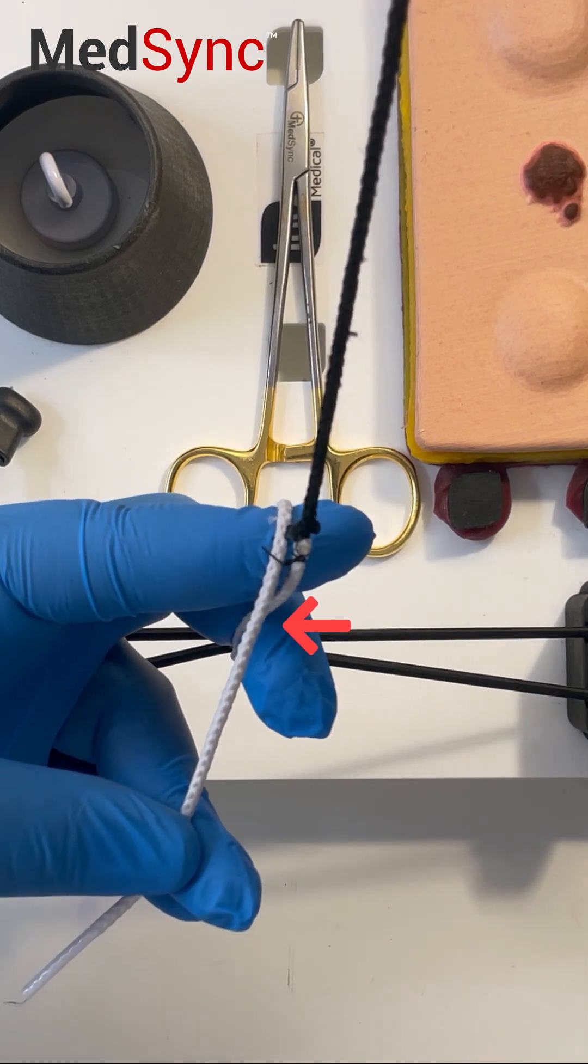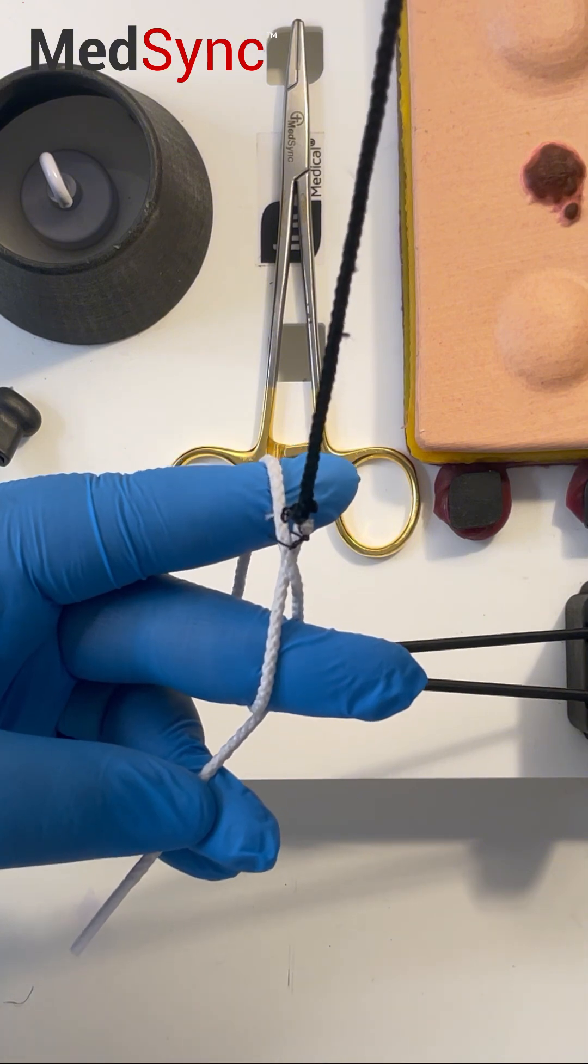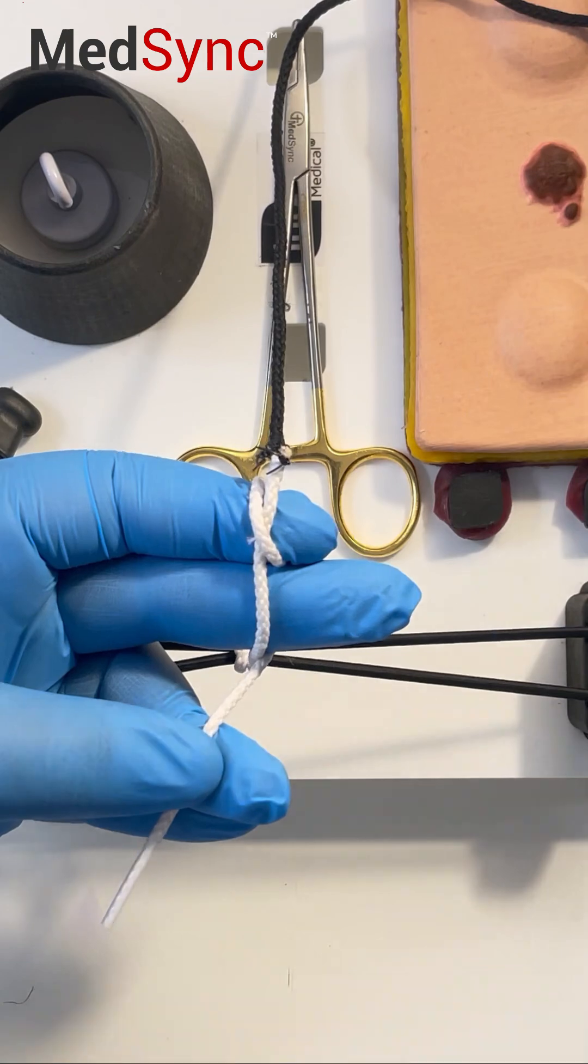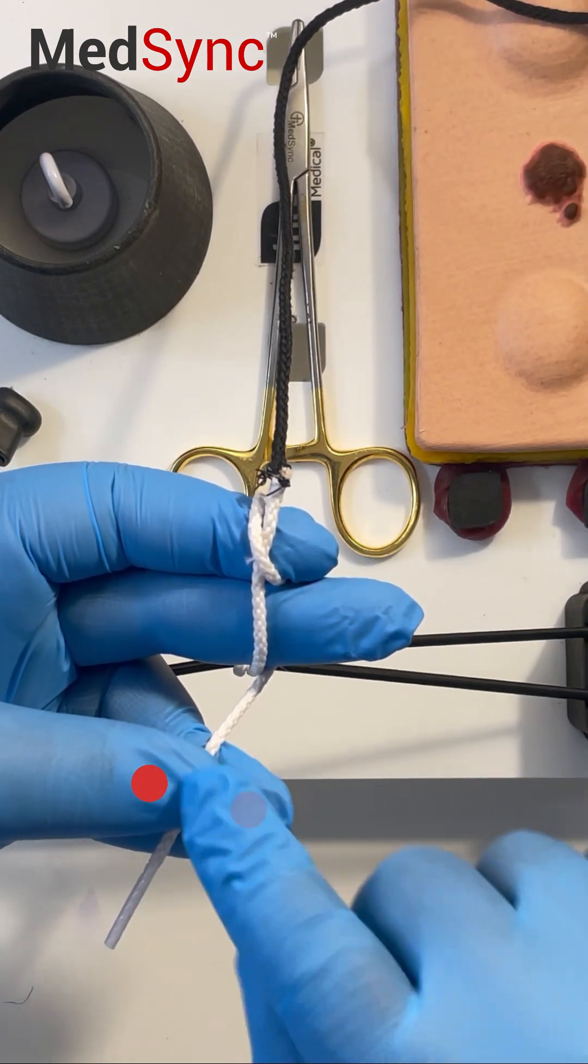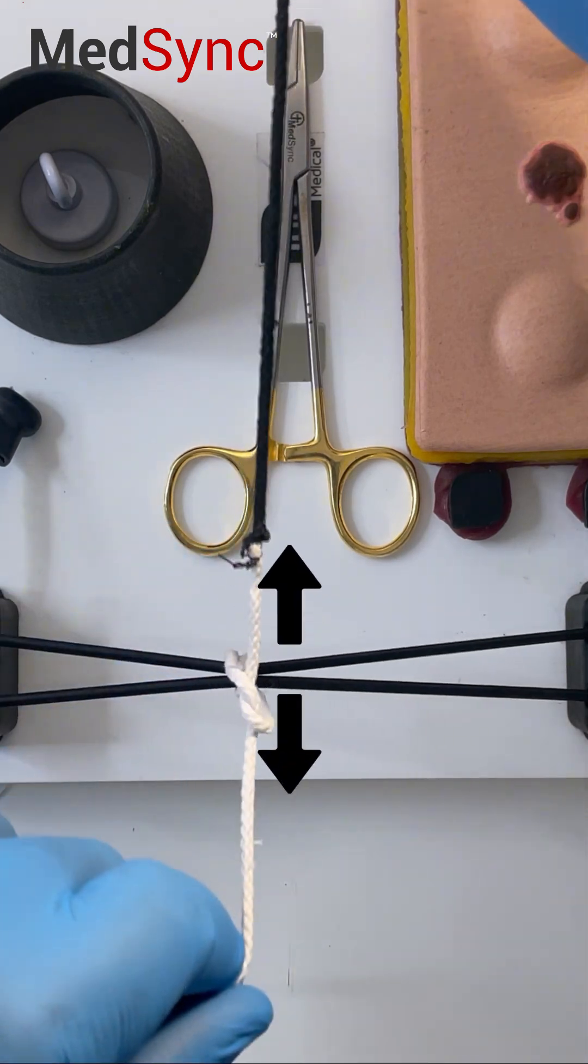Bend your middle finger over the long under the short. Squeeze it between your index and middle. Let go between your thumb and ring and pull the short suture through the loop.